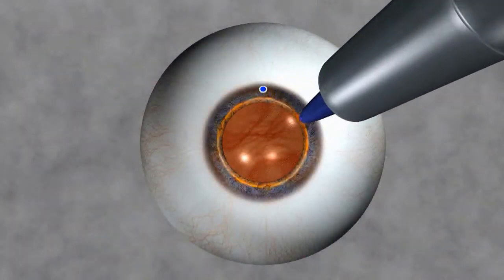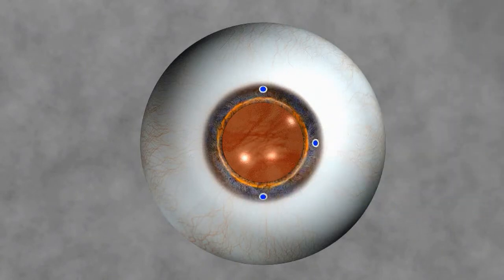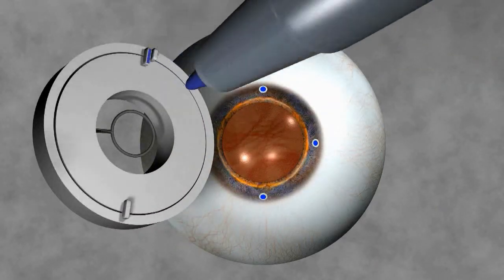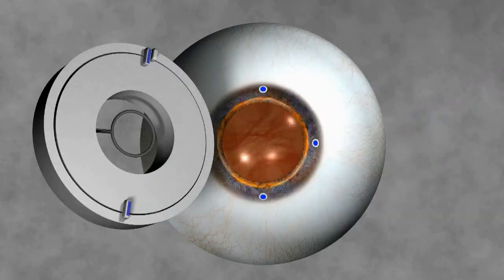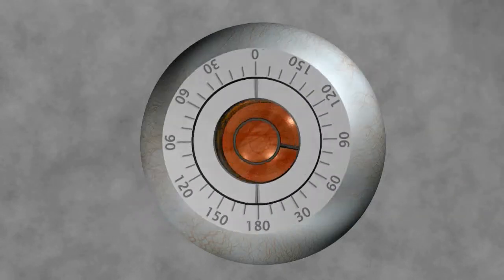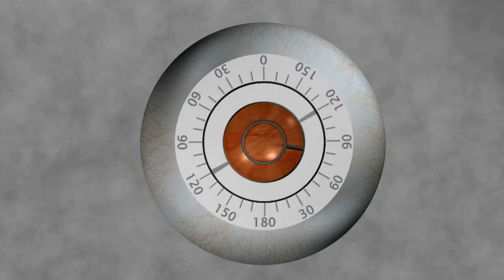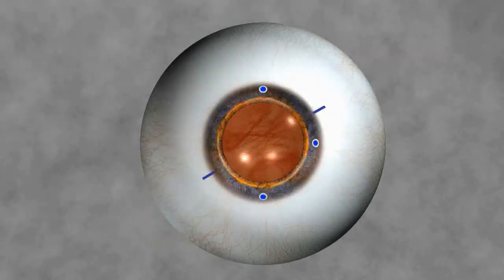If using a marker, the surgeon rotates the dial to the precise degree where the steep axis of the astigmatism was identified, then the foot plate is inked. Using the 0, 90, and 180 degree reference points, the inked face of the marker is placed upon the cornea and gently pressed. The result reveals two linear marks 180 degrees from one another, representing the alignment of the steep axis of the astigmatism.